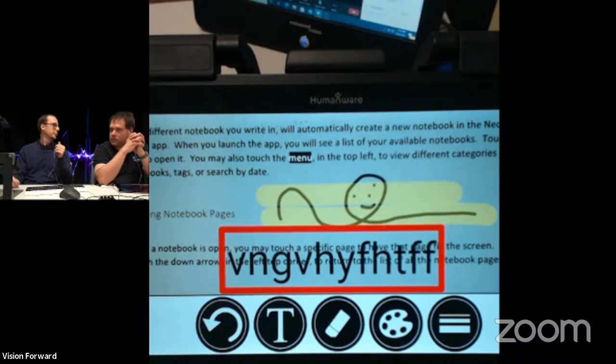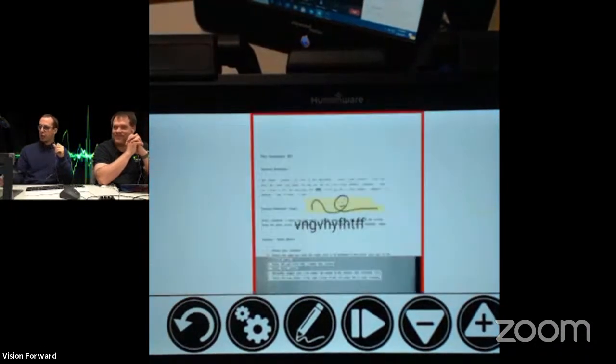I was going to say that these annotation tools are specific to low vision users, but this device as a whole is really geared to all low vision users. Exactly. I was thinking we were in the OCR piece, but you're right. For this one, it's definitely going to be geared toward low vision users. So let's get out of here.